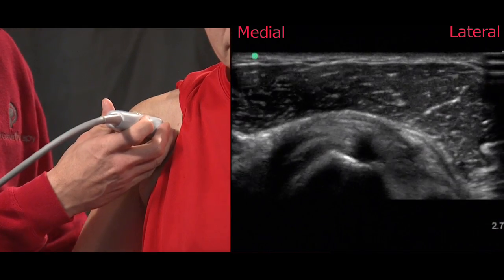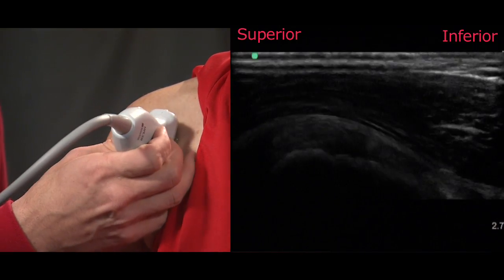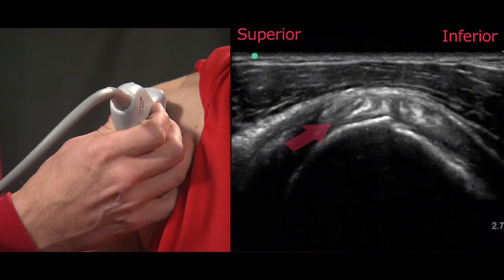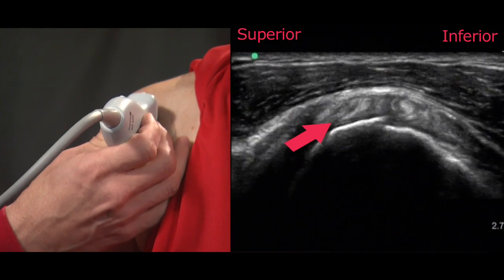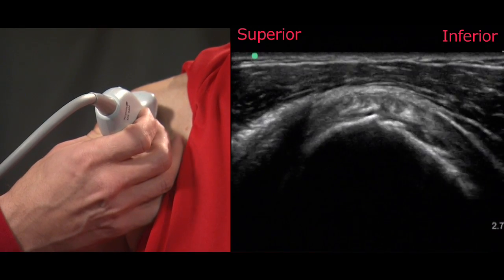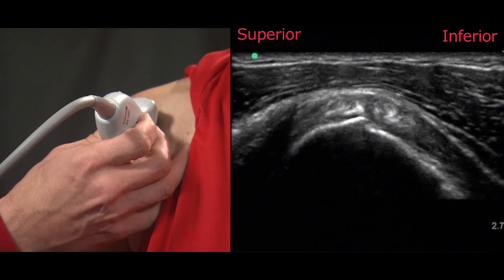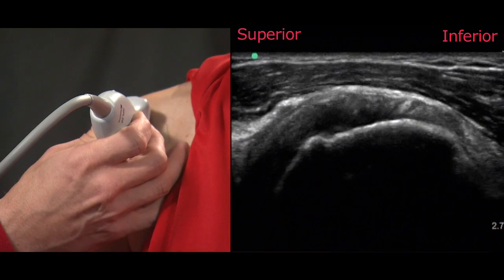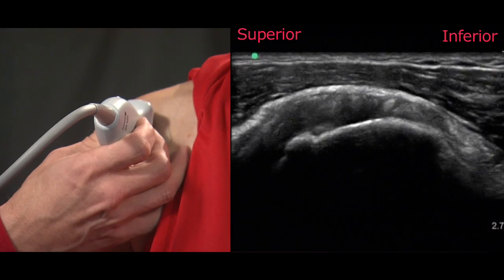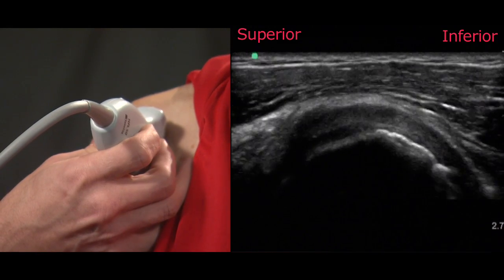Once we've completed our long axis examination we'll change the probe's orientation to examine the short axis of the tendon, which is unique in comparison to the other rotator cuff tendons as it has this unique honeycomb-shaped appearance. It's important not to mistake this appearance with any type of defect or partial thickness tearing, as the hyperechoic or bright intratendinous slips are enveloped by the muscle. As we slide along the length of the tendon we're carefully looking for any type of defect.